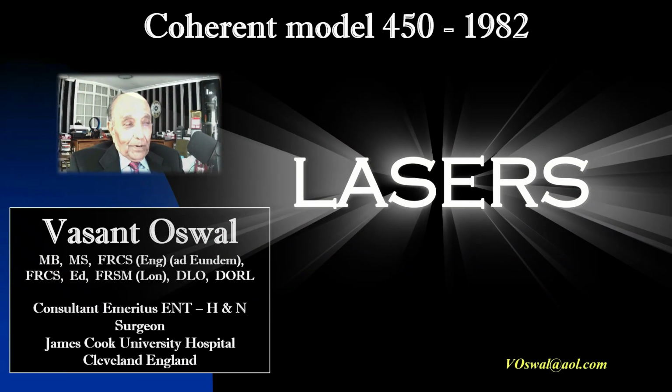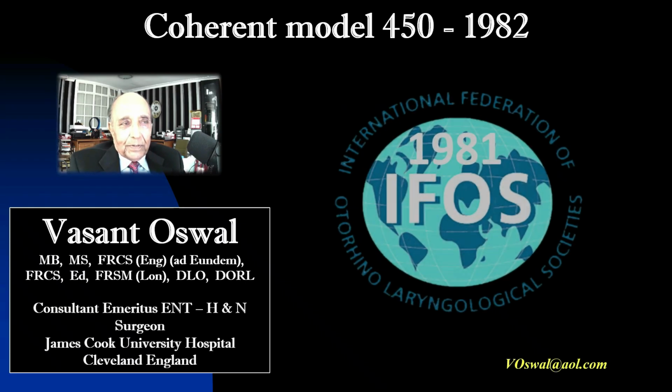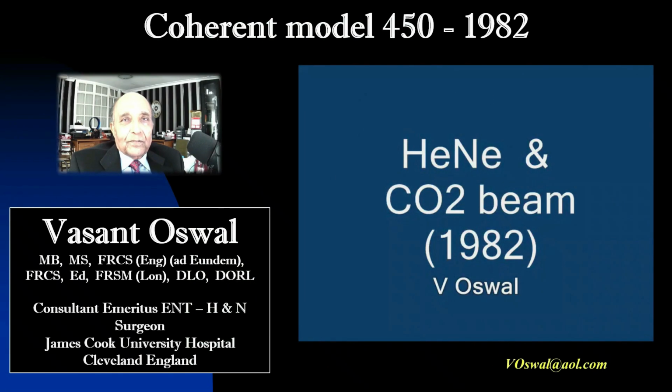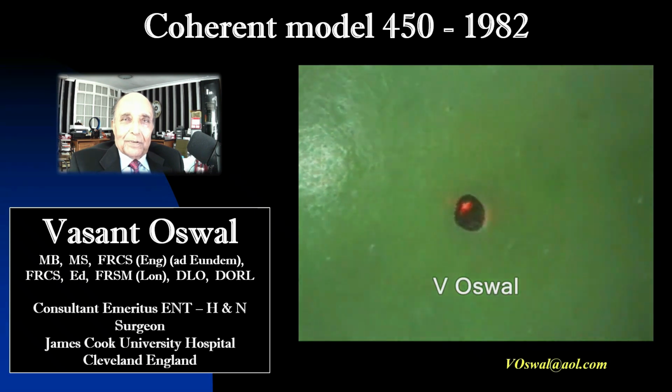My interest in laser goes back to the 70s. In the early 70s, there were a few prototypes exhibited in various conferences. During IFOS conference of World ENT Surgeons in Budapest in 1981, coherent 450 model was demonstrated in the exhibition area. I tried, it was fascinating. A beam without a handle burned the surface of the apple and vaporized it.